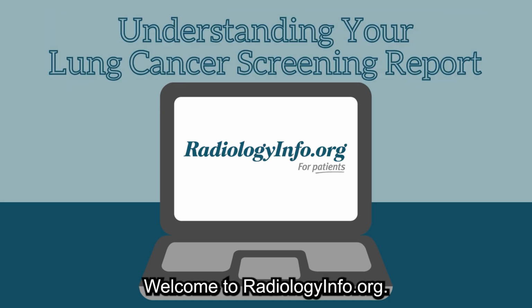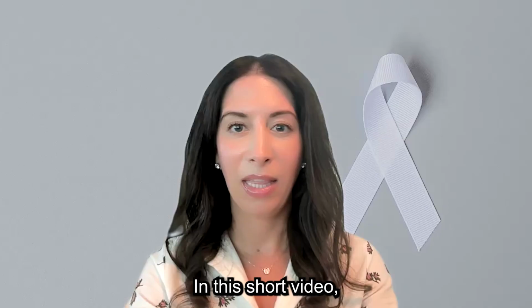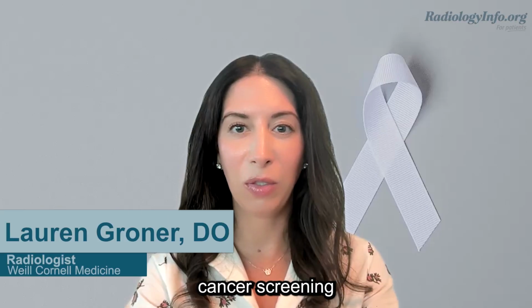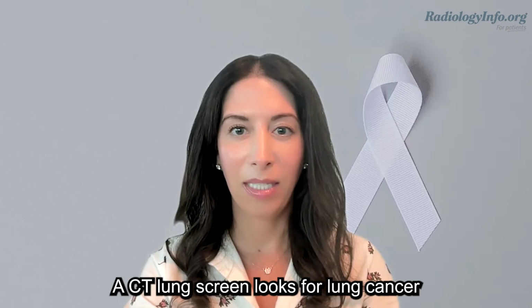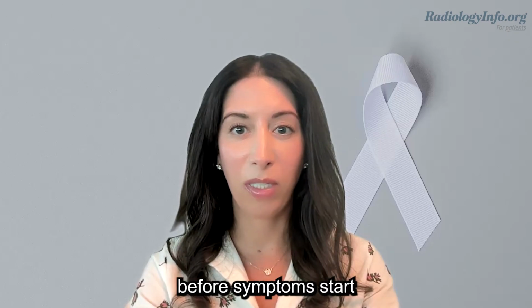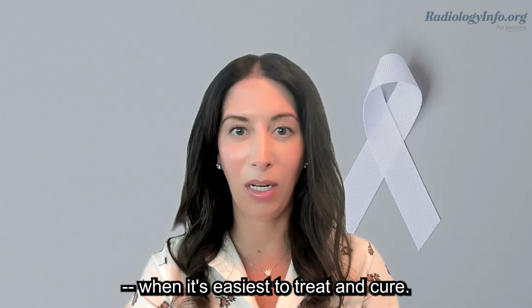Welcome to radiologyinfo.org. In this short video, I'll walk you through your lung cancer screening report and help make the medical language a little easier to understand. A CT lung screen looks for lung cancer before symptoms start, when it's easiest to treat and cure.